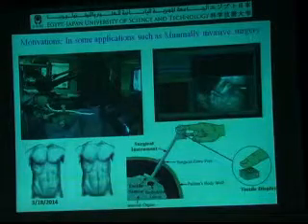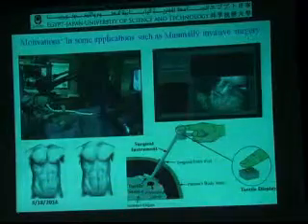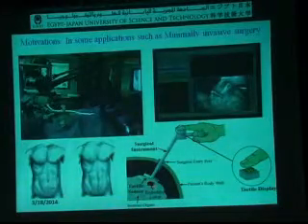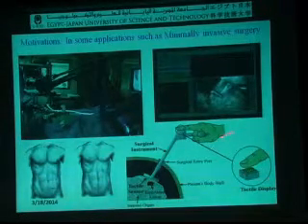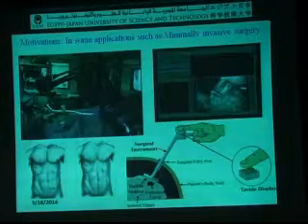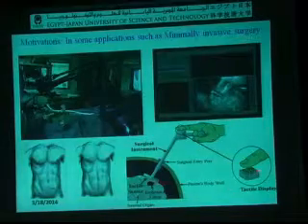So we think to have such a system, to put some instrument with a tactile sensor, and we can sense the softness of the tissue and transfer this signal to some kind of tactile display. My department is developing tactile sensor and tactile display and also the robotic system. So my outline is divided as development of robotic system, which is here, and development of the tactile sensing system, which consists of tactile sensor and tactile display.